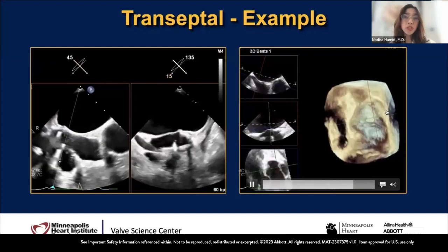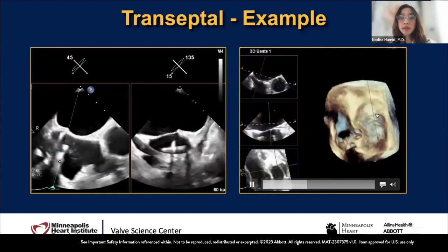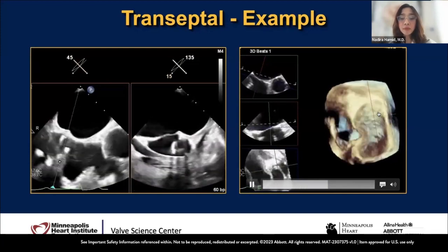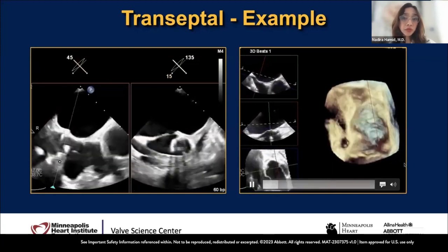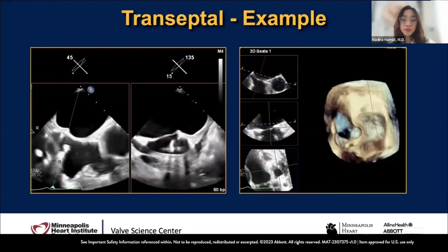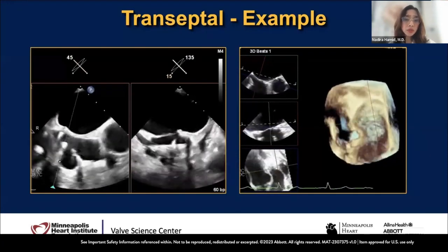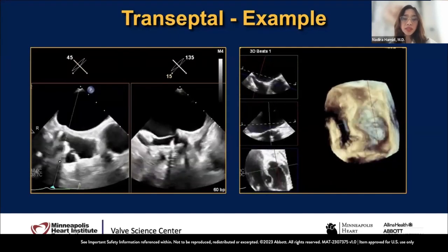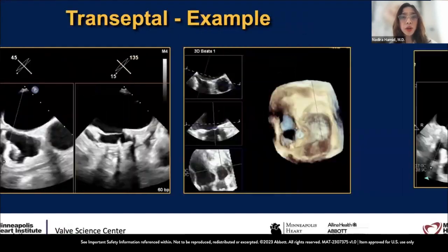And so I will freeze this image and take a measurement right from here. You can see the needle poking, and take a measurement from here all the way down to the mitral annulus. And we've been really successful in this. And so, most of the cases I just double check with this. So something to think about and to do in your practice.